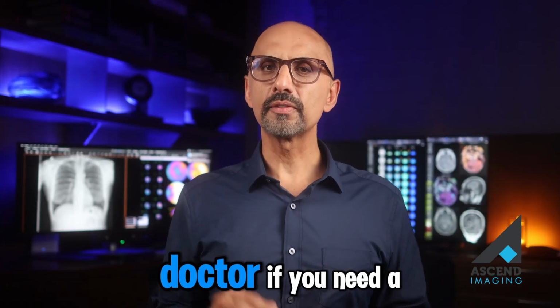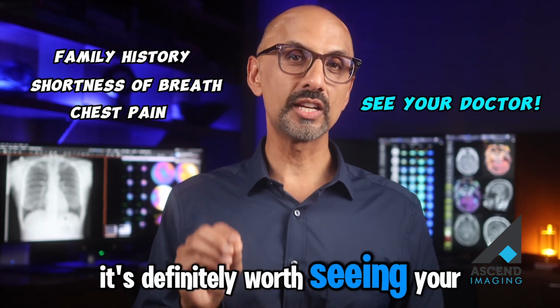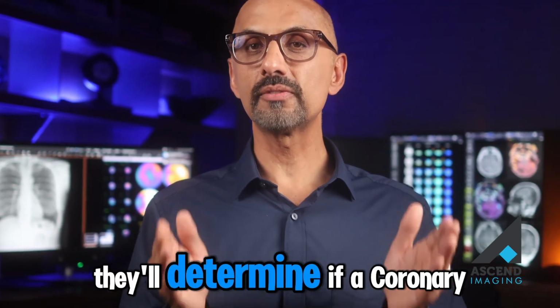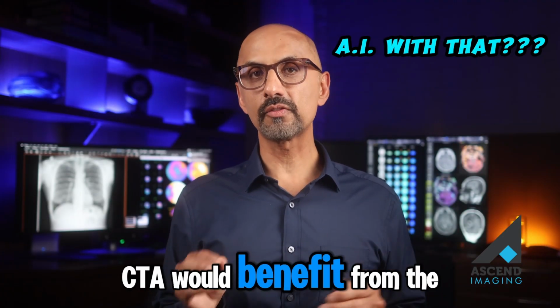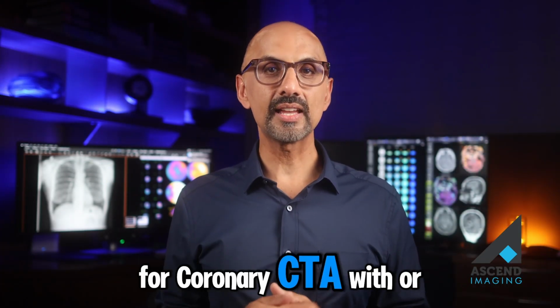Now, should you ask your doctor if you need a coronary CT angiogram? If you're experiencing symptoms like chest pain or shortness of breath, or if you have a family history of heart disease, it's definitely worth seeing your doctor and having that conversation. After assessing your risk factors and performing a clinical evaluation, they'll determine if a coronary CTA is appropriate for you. It's also worth asking your doctor if they think your coronary CTA would benefit from the added AI technology we touched upon.